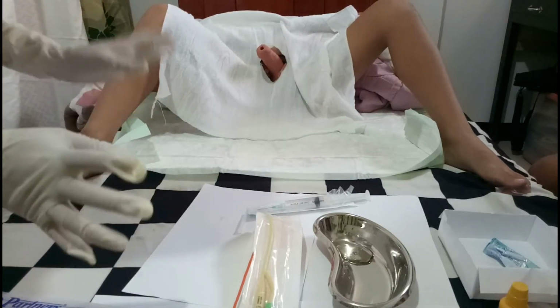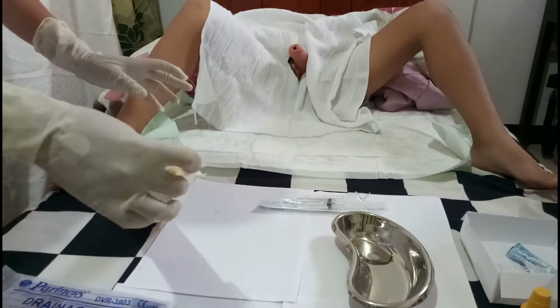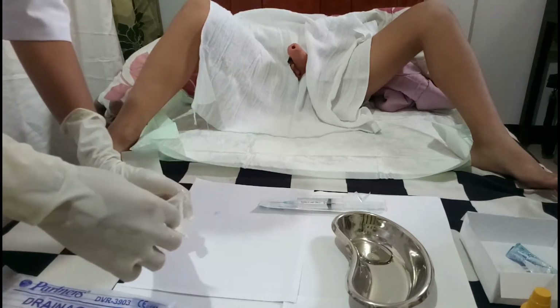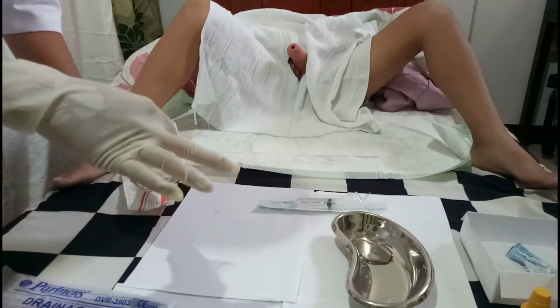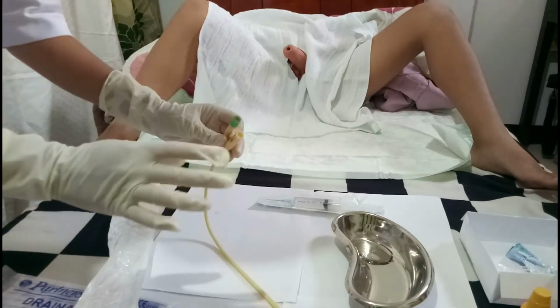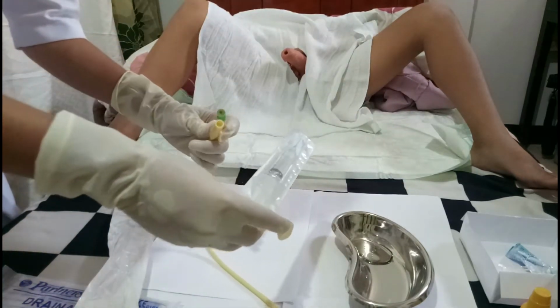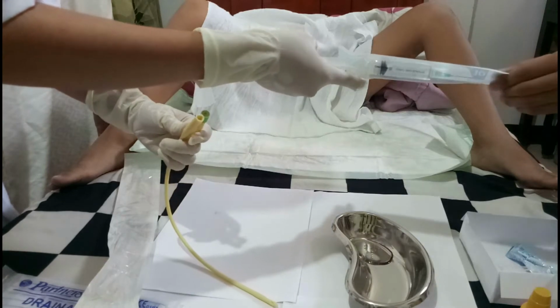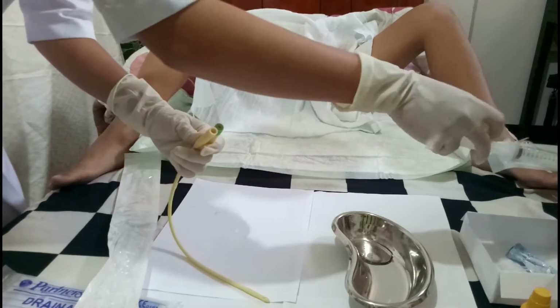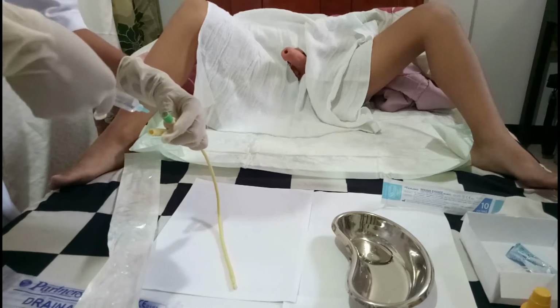In the next one, I'm going to ready the catheter on the sterile field. So now I'm going to open the catheter and maintain the sterility of it. I'm going to get it. So now I'm going to attach the syringe into the catheter. Can you get this one for me? Get it on the ground. Thank you. Then attach it here.